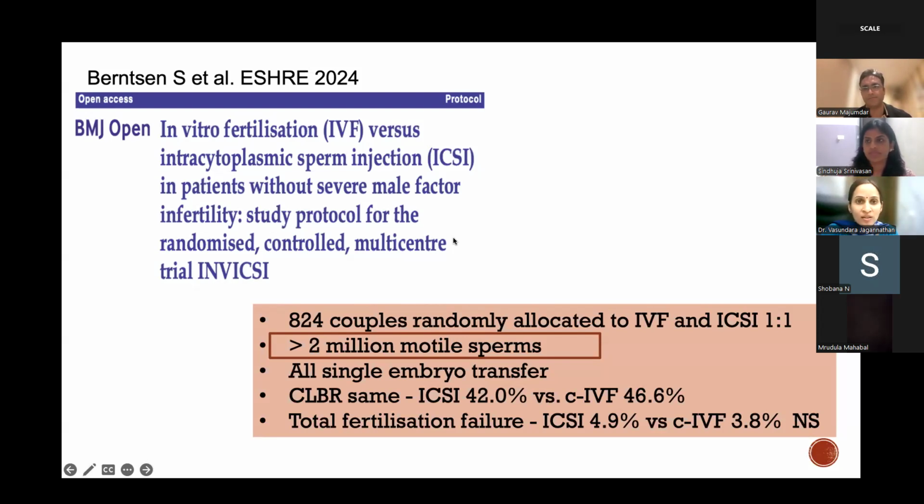So in other words, what is the criteria for short incubation? You can perform short incubation when you are doing conventional IVF for fewer eggs. But in cases where you're suspecting an oocyte issue in terms of maturity, we have nothing against short incubation. We have done short incubation for the longest time. And it's good if you can subject them to 4 hours of insemination, then you can go ahead. There's no harm in doing that.